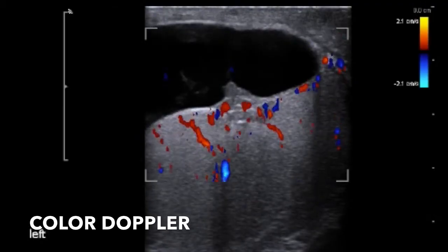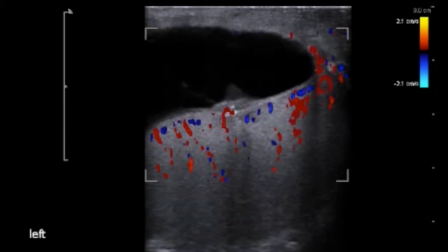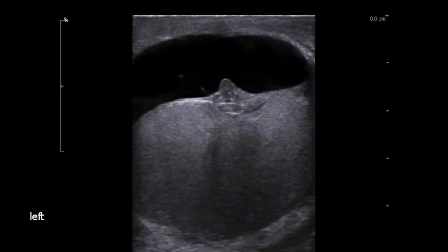With color flow Doppler ultrasound, good blood flow was visualized except for the tissue extruding through this tunica albuginea and in the region of the testicular hematoma. This case demonstrates the ease and speed of identification of traumatic injury to the testis with the survey scan.